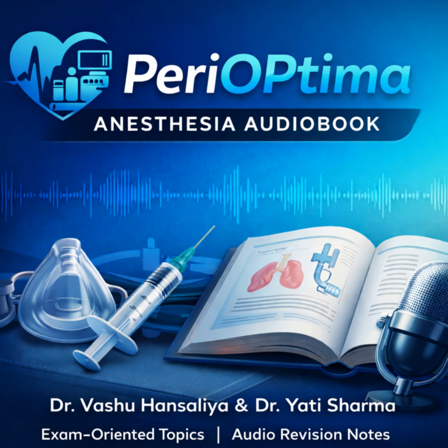Inflation must be triggered at the dicrotic notch on the aortic pressure waveform. And what does that correspond to anatomically? Anatomically, this corresponds to the closure of the aortic valve. The heart has finished ejecting, the valve snaps shut, and then, in that instant, the balloon inflates. Not before. Not a millisecond before. And deflation is triggered immediately before systole. Specifically, it must happen during the phase of isovolumetric contraction, just before the aortic valve opens. The balloon must be fully collapsed before the heart tries to eject blood. Okay, inflation at the dicrotic notch, deflation before systole.